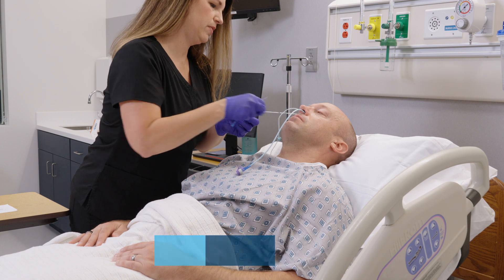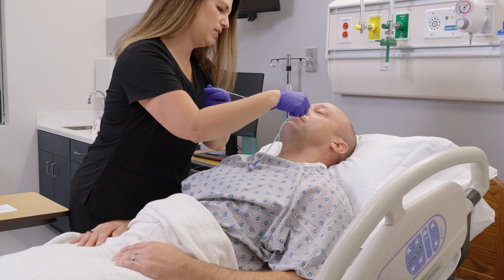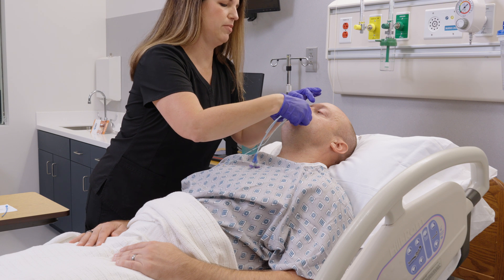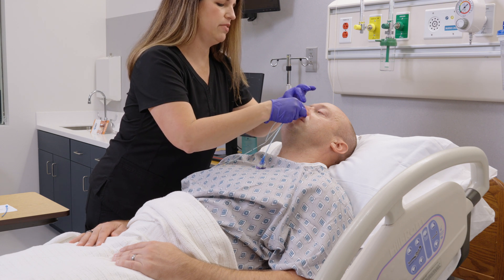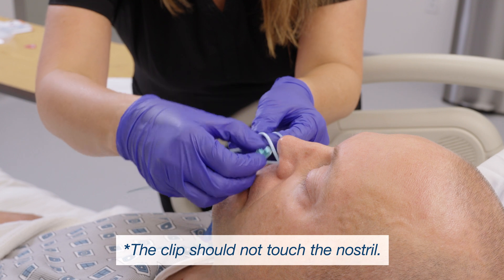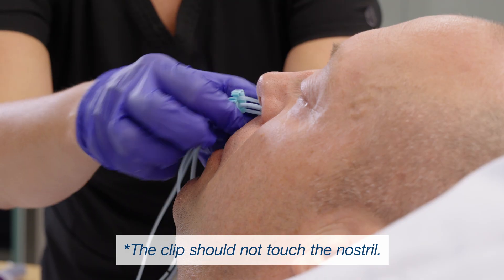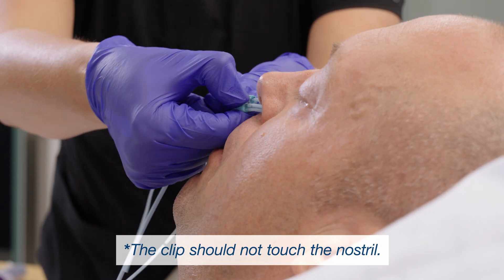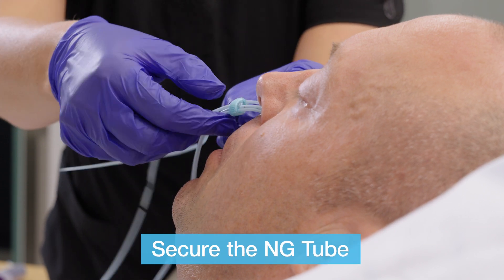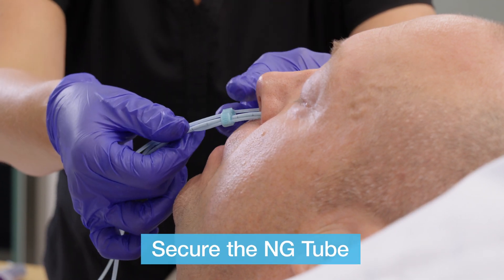Once the magnets are a few inches outside the nostril, you are now able to cut and dispose of the bridal tube section containing the magnet, black markings, and the blue probe. You may now slide the bridal probe into position. The clip should be located approximately one centimeter or one finger width from the nostril. With the clip in position, the nasal tube can be placed within the channel of the bridal probe.